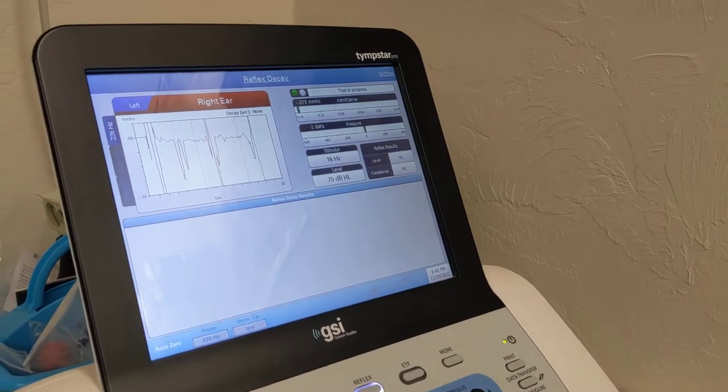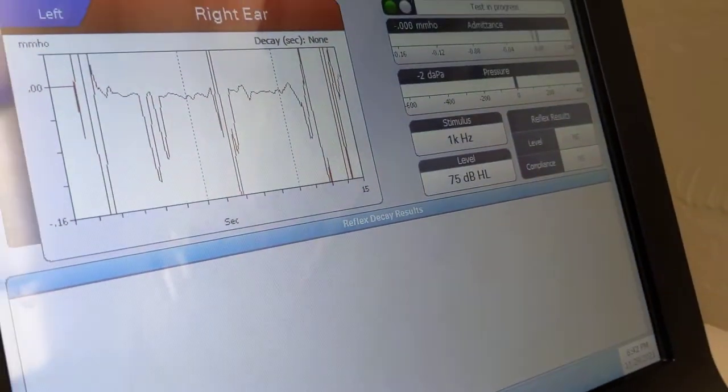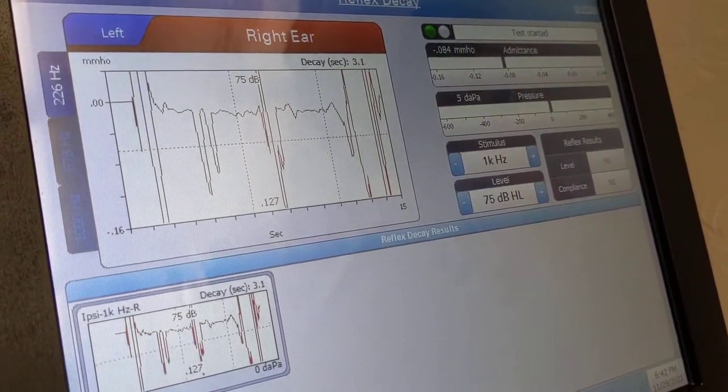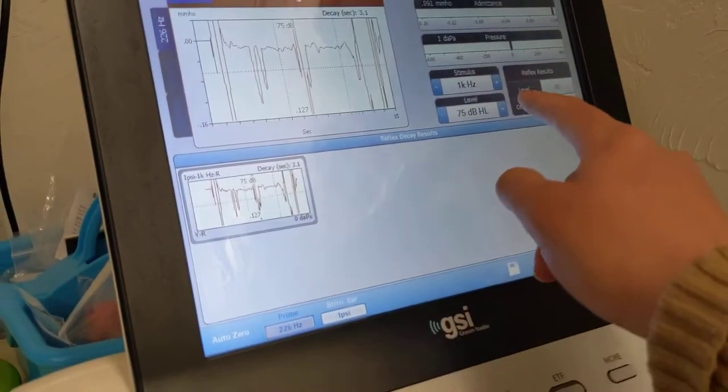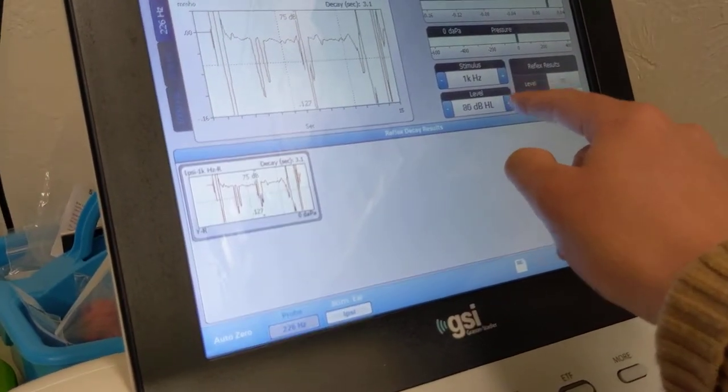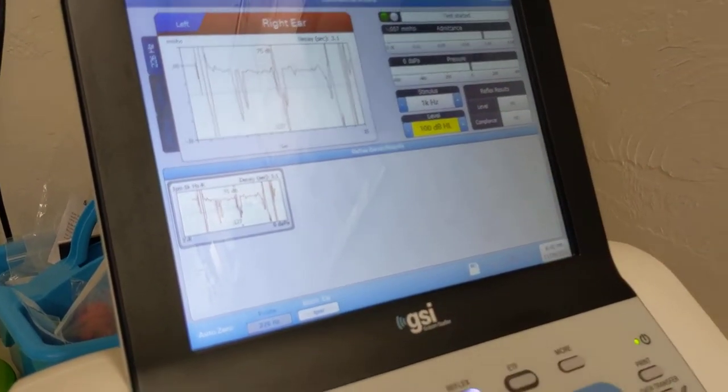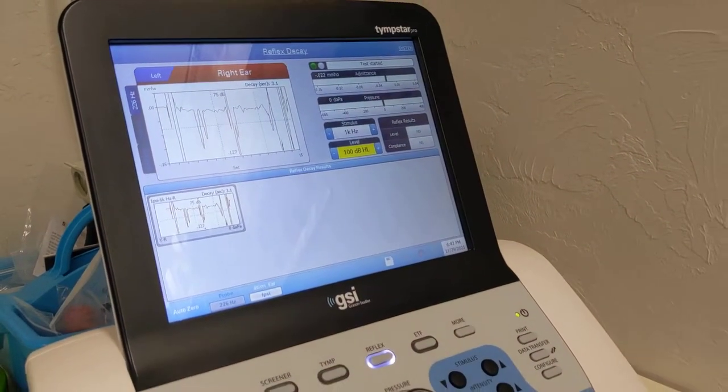Okay, so this was an interesting example. You can see we have tons of artifacts. It's super jaggedy. So let's try this one again and go up to 100. And present.